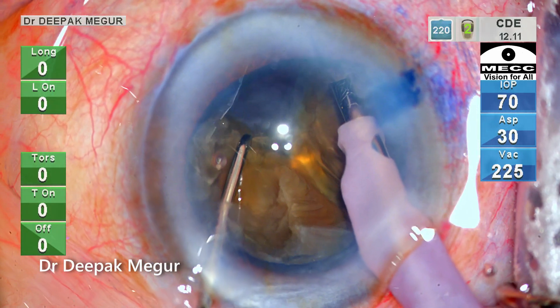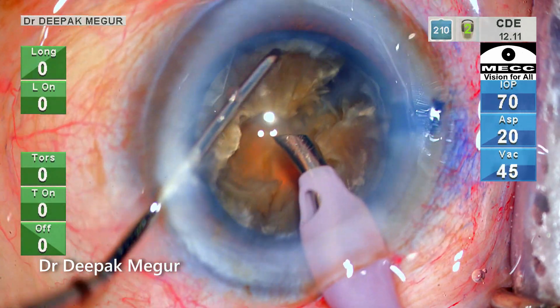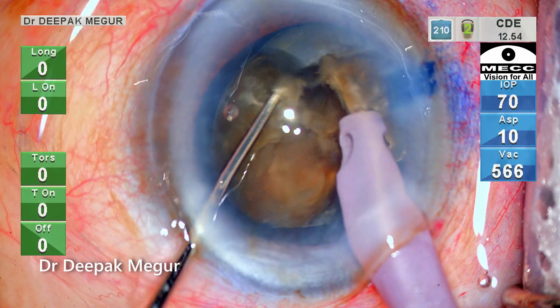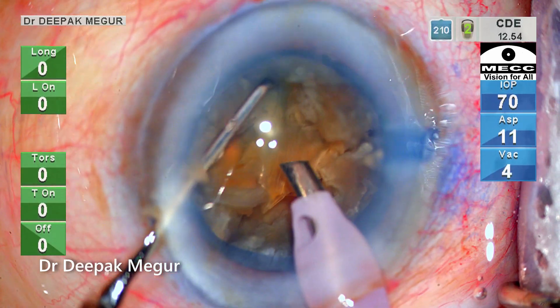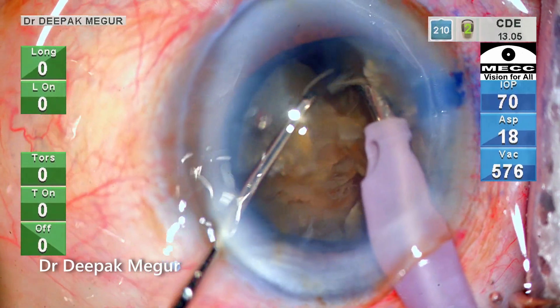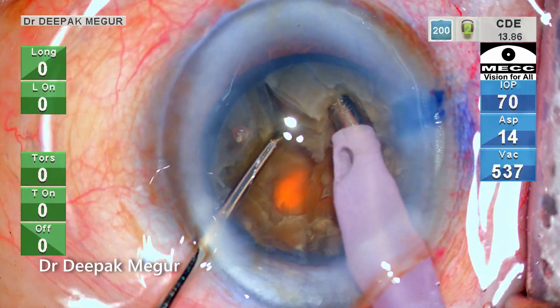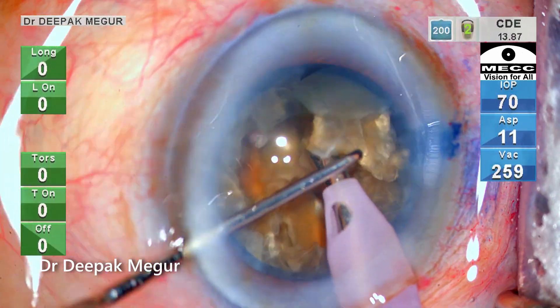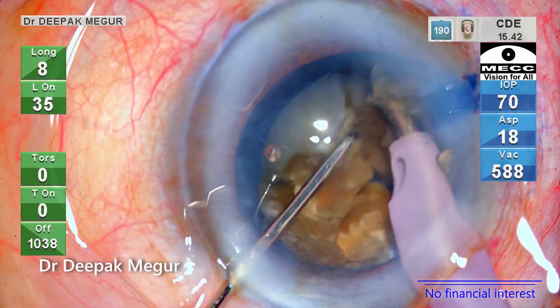Lateral separation needs to be done at progressively deeper planes until the posterior plate separates. Please note the direction of the tip — it is turned to the other side while burying and chopping so that I don't lose the grip during lateral separation. My preferred way is to hold the tip the other way, especially during quadrant removal. In such hard cataracts, I make it a point to always turn it the other way around so disengagement does not happen during lateral separation. The tip is a 45-degree bevel tip — a very thin, standard tip which Alcon provides in India.